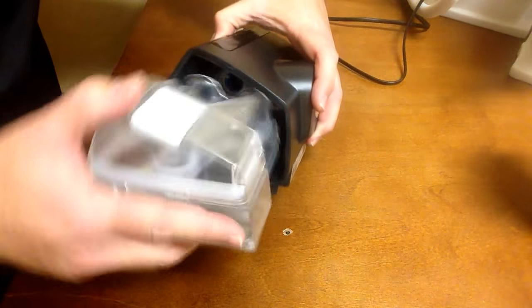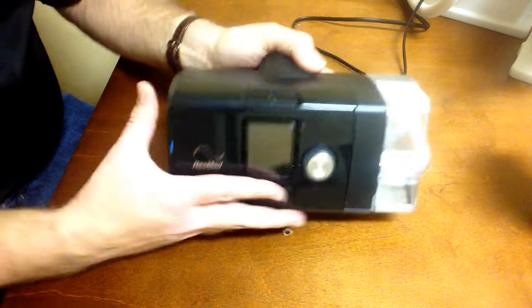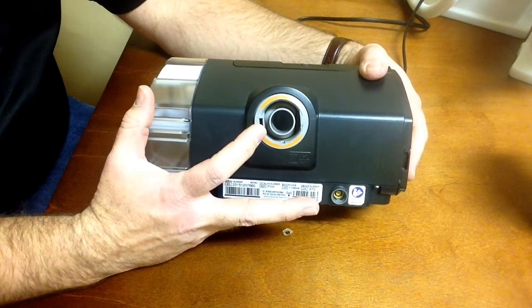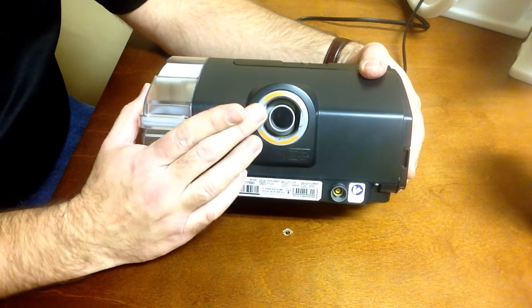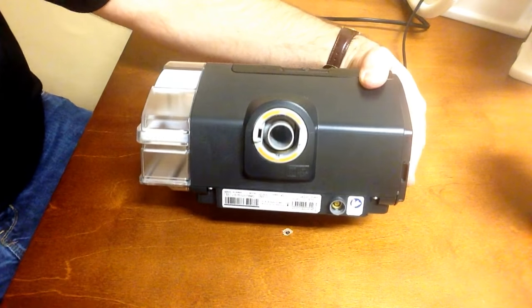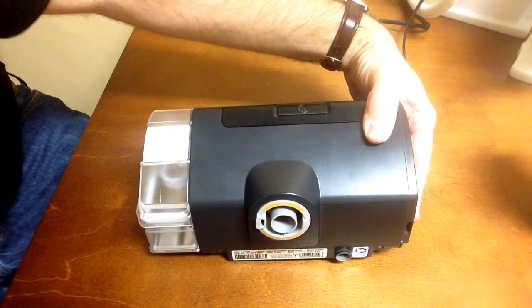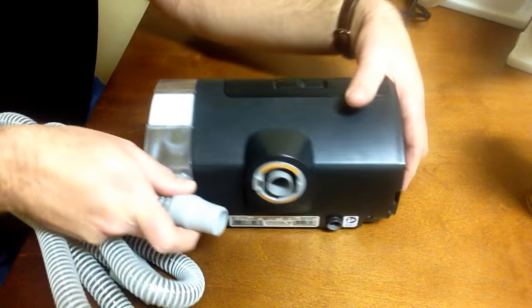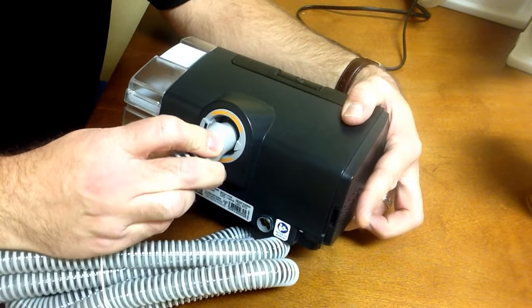The humidifier simply slides back into that spot. On the back side of the unit, you have your tube attachment. There are two options: either you can use any standard tubing — non-heated tubing — with that rubber cuff simply pressing on the back side of the unit.